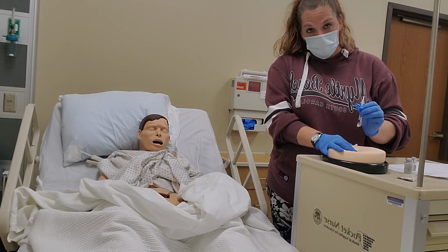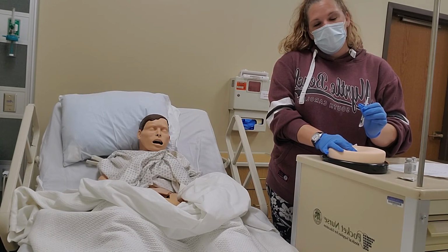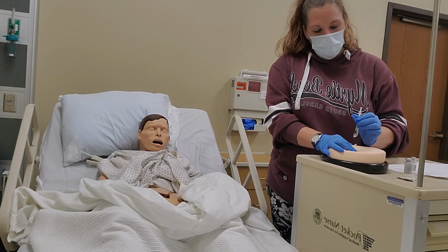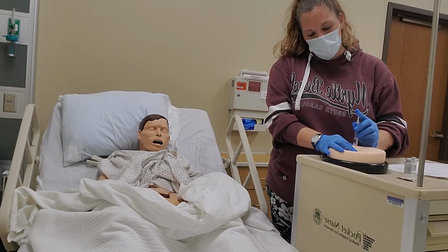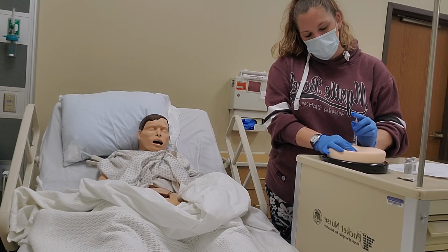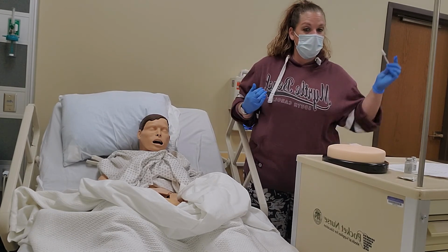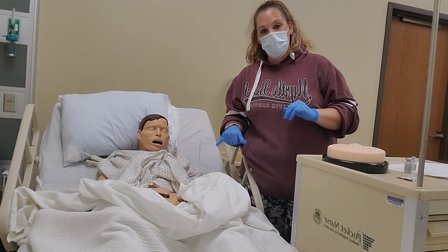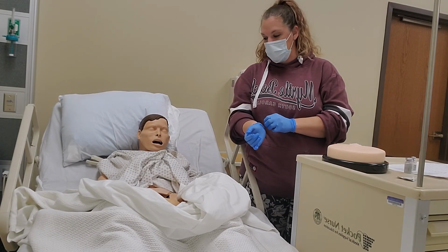I'm gonna go at 90 degrees. If he was emaciated, malnourished, I would actually go to 45. And obese people, you go 90. So on 3, you're gonna feel a pinch. 1, 2, 3. And slowly inject. And straight out. And then cap, safety, into the sharp. I would document the area that I gave it in. He's not bleeding. He shouldn't bleed. There isn't a lot of vascular there.